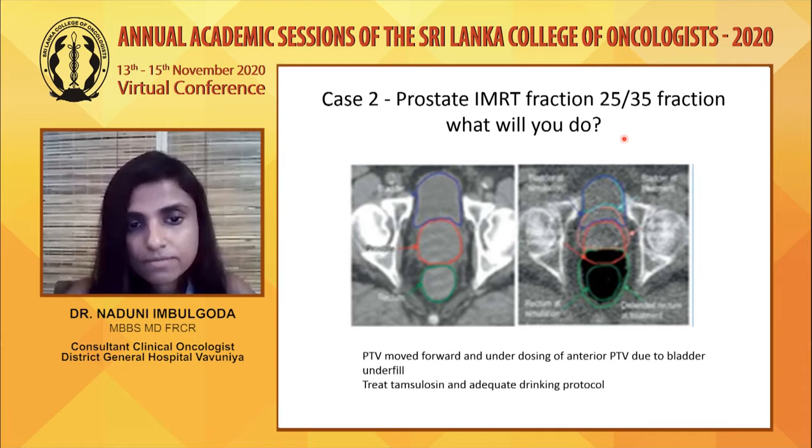that they maintained at the first fraction. So we need to ensure that there's an adequate drinking protocol, and we should adjust the tamsulosin dose, because most patients on prostate RT are on tamsulosin. We might need to increase the tamsulosin dose so that they can keep a comfortably full bladder.